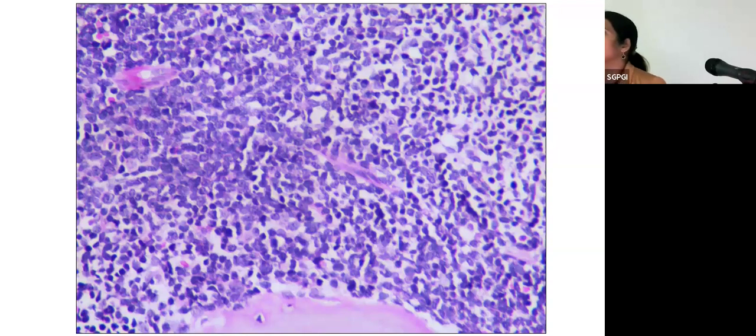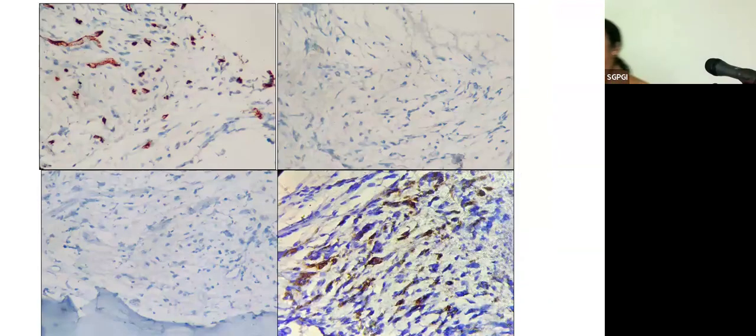In which leukemia does fibrosis occur? Somebody said M7? Very good. So what we did next was we put an IHC on the bone marrow biopsy looking at the fibrosis. This is CD34, which was positive in a few cells.